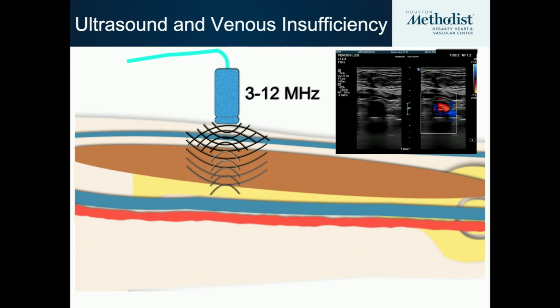You don't know what is in there. There are also some echoes. You can see there the artery on the right side where the color red is present, and then on the left, without the color, you can see there is an image below the artery that simulates a reflection. That's an echo. That's an artifact, because the images are not good, because of some interference with itself as the wave rebounds and goes back into the probe.